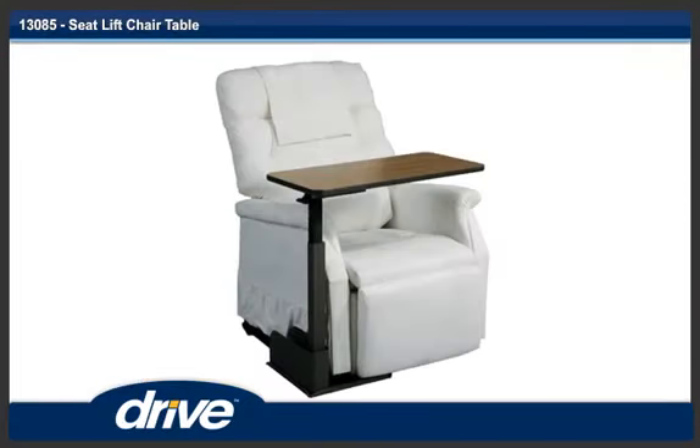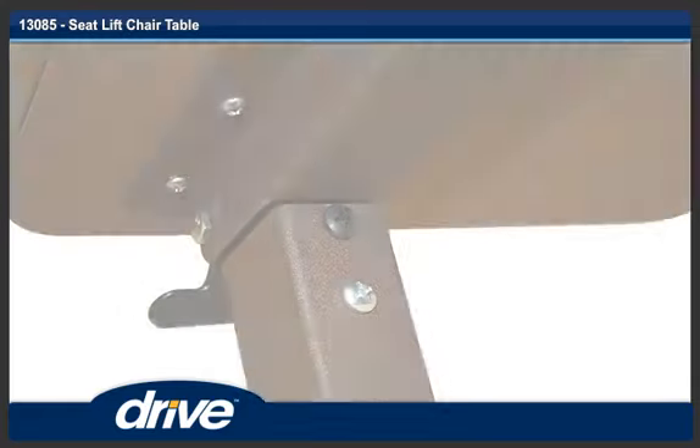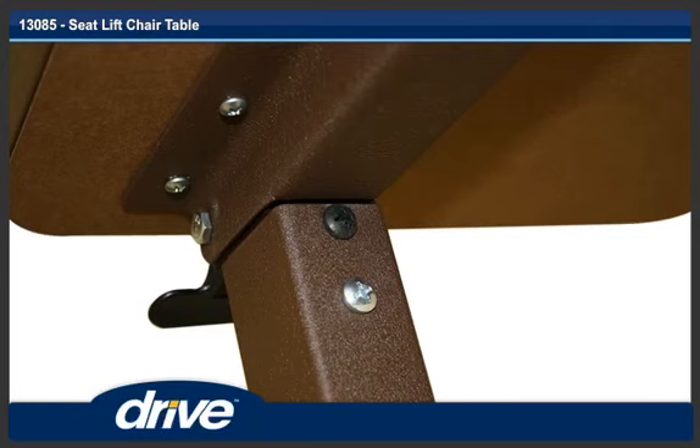Step 9. The base must be placed under the seat lift chair before the mast is inserted on the base, to prevent the table from tipping over. Step 10. Remove the warning label from the column of the mast.